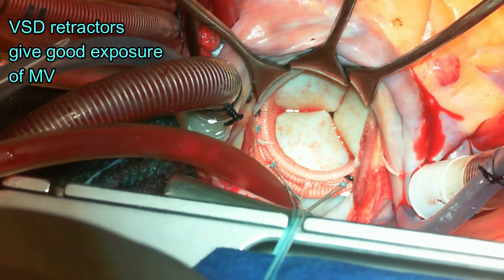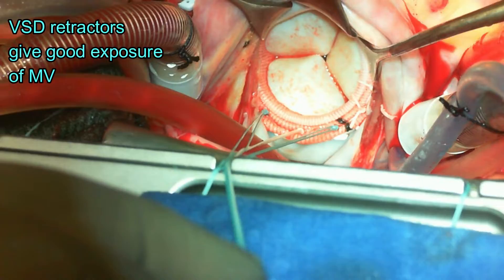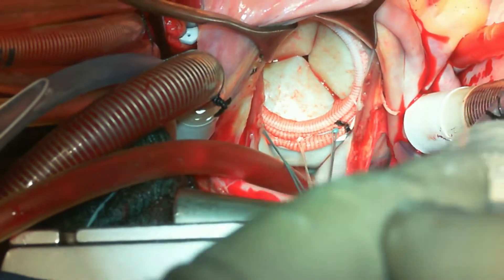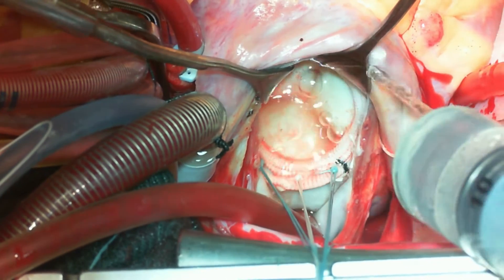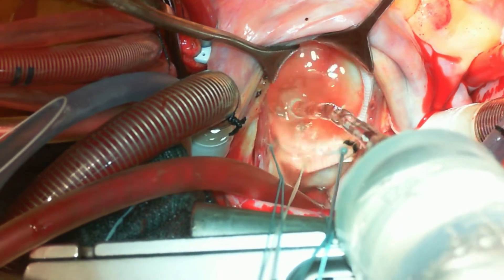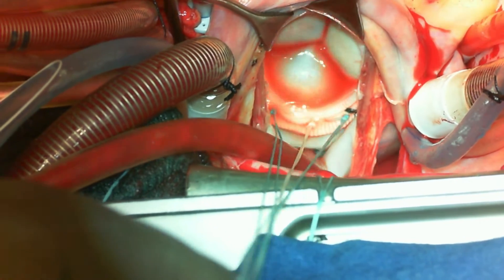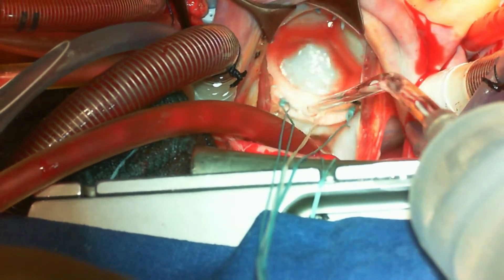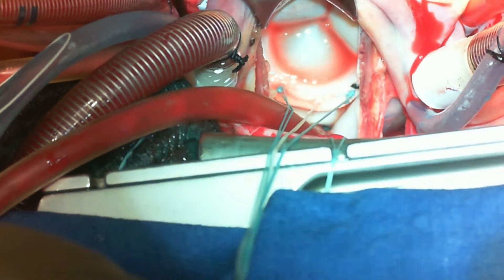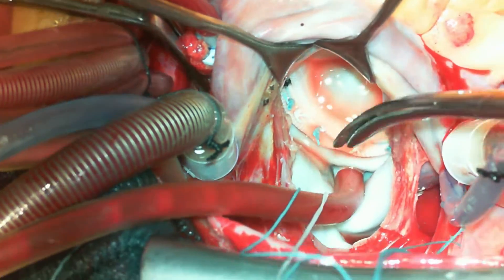We would not disturb the valve by opening the leaflets. We just pour in some saline to get rid of any small debris that may be in the left atrium. This is not valve testing — this is a mitral position and the valve is supposed to be allowing flow from the left atrium into the left ventricle. The remaining sutures are then cut and the left atrium is prepared for closure.